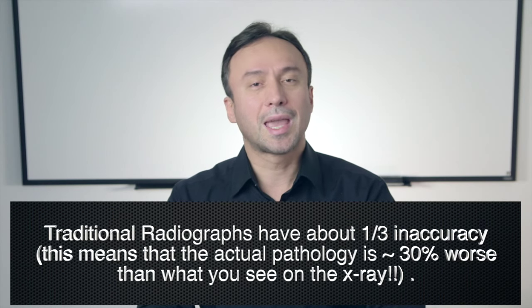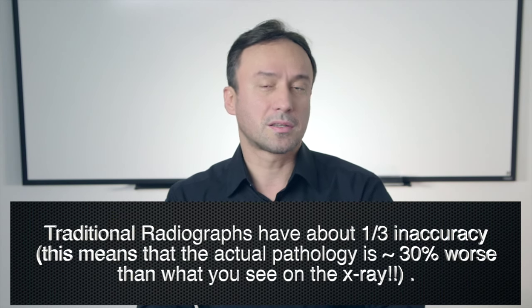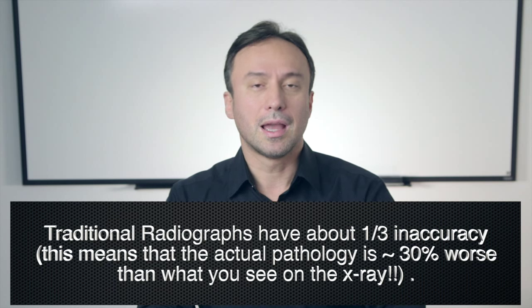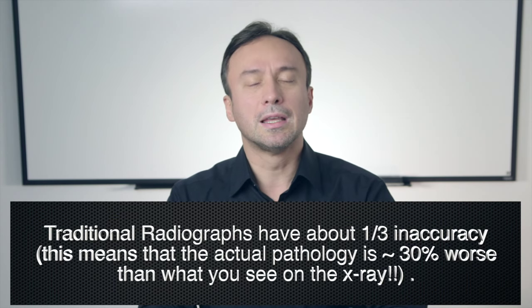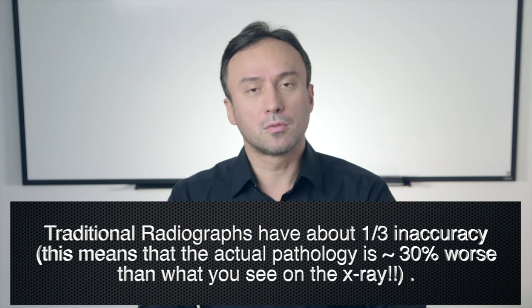Don't forget that radiographs only have a certain amount of resolution, so what you cannot see in a radiograph does not necessarily mean it's not there — it could be there. So usually, if needed, we can do the root canal using microscopic treatment and microvision, where you're able to see a lot better and have a better chance at finding these canals.